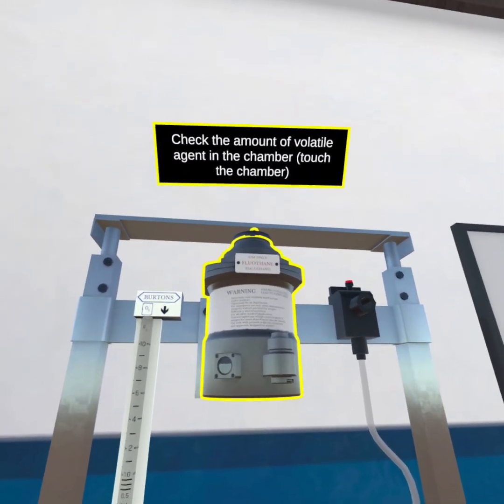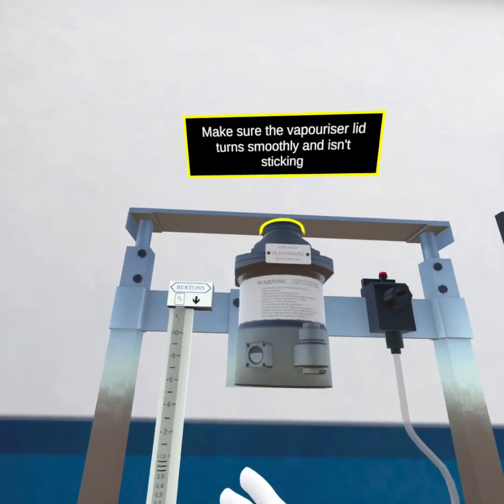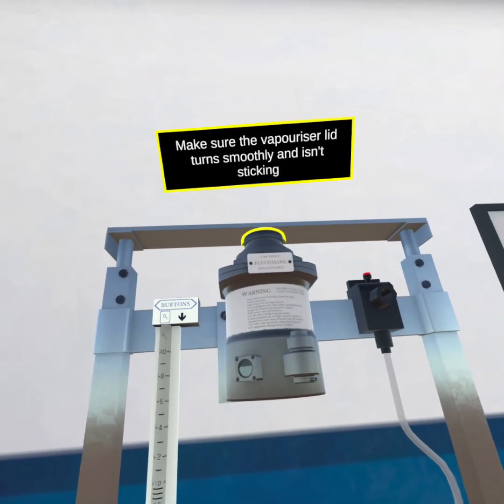Check the amount of volatile agent in the chamber. Touch the chamber and make sure the vaporizer lid turns smoothly and isn't sticking.